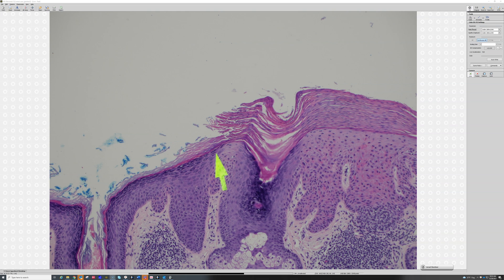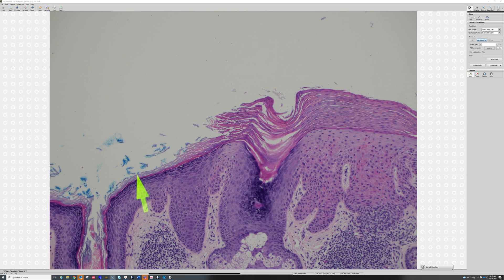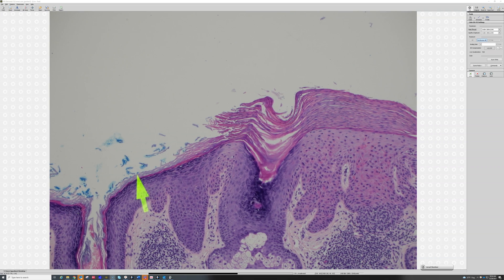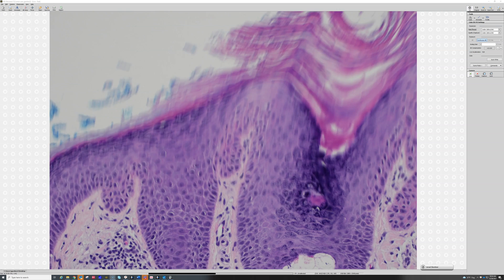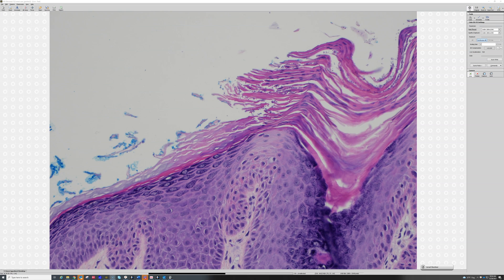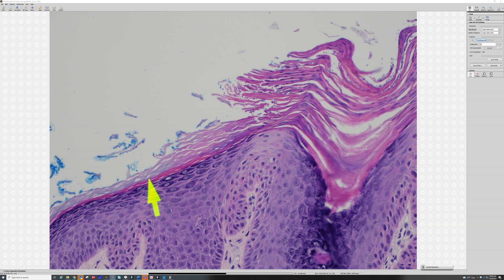Right next to it, you have a nice thick granular layer and orthokeratosis on top. In this case the orthokeratin is a little compacted, and the granular layer is thicker than usual. That's because this patient has been picking and scratching at their actinic keratosis — this is a reactive change to the epidermis. It gets thicker, it gets hypergranulosis, and it gets kind of compact, dense keratin, with a little band called the stratum lucidum, which is normally only present in the palms and soles or in skin that's been scratched.